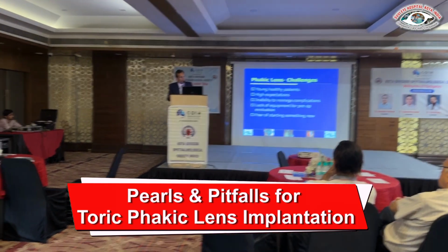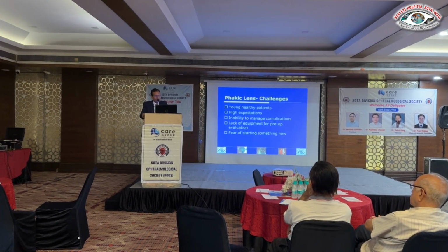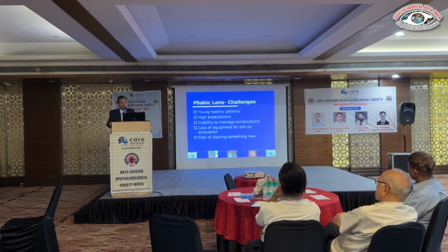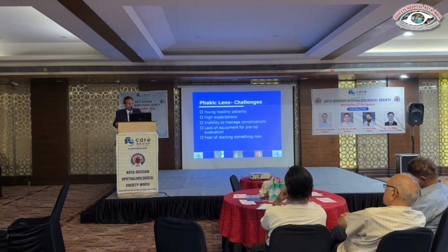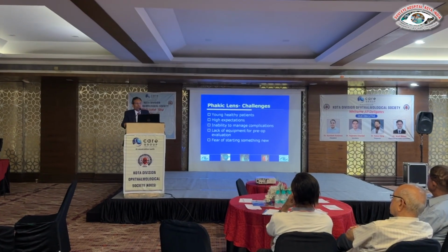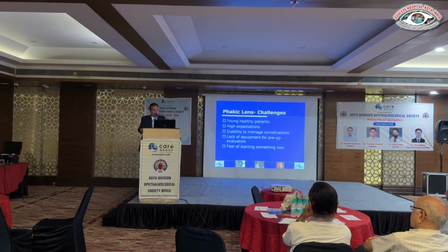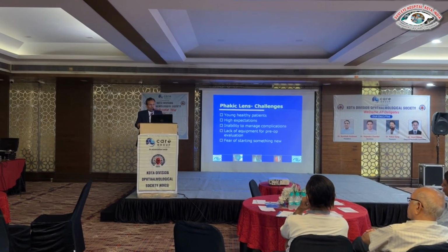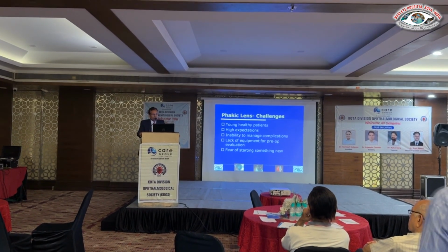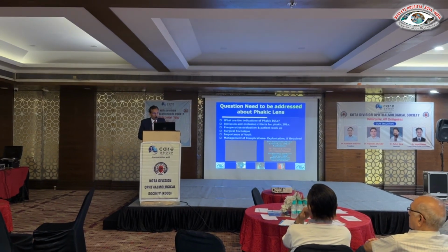So the Phakic lens is challenging because most of these cases are young patients. They have very high expectations, and sometimes the surgeons, especially beginner surgeons, are scared to start the Phakic lens because of inability to manage complications. Sometimes in the beginning of practice, we lack the equipment for pre-operative evaluation, which includes corneal topography such as Pentacam, optical biometry, etc. And of course, there is always a fear of starting something new.